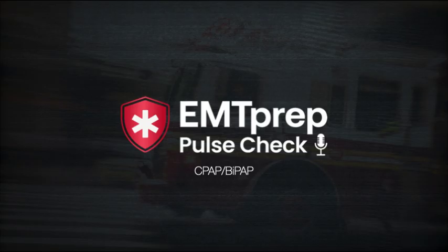The early introduction of CPAP and BiPAP are definitely beneficial for a patient in respiratory distress. The primary reason for this is it can address a lot of the symptoms and help to treat the underlying condition that's causing the respiratory distress, which would prevent a patient from having to be intubated and placed on a ventilator. Thanks for joining us for this quiz on CPAP and BiPAP.